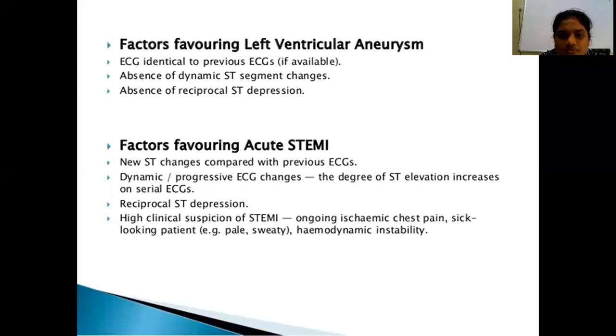Then the factors favoring acute STEMI are new ST segment changes compared to the previous ECG and progression in the ECG changes. So the degree of ST segment elevation increases on serial ECGs. Reciprocal ST depressions are seen.